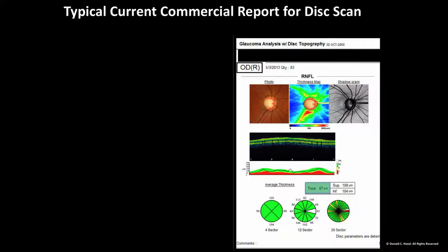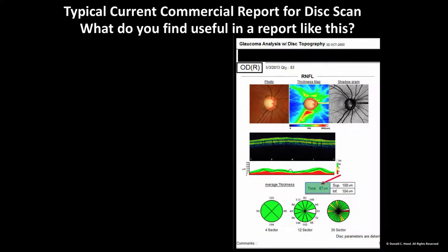Here's a typical current commercial report. When I lecture on this to ophthalmologists and optometrists, I ask people what they look at in a report such as this. Do they look at the average total thickness here? Most individuals say yes. Do they look at the quadrant thickness? Again, most say yes. How about the clock hours? Fewer say yes, but some do. What about the actual thickness plot? The answer is often yes, but not always.